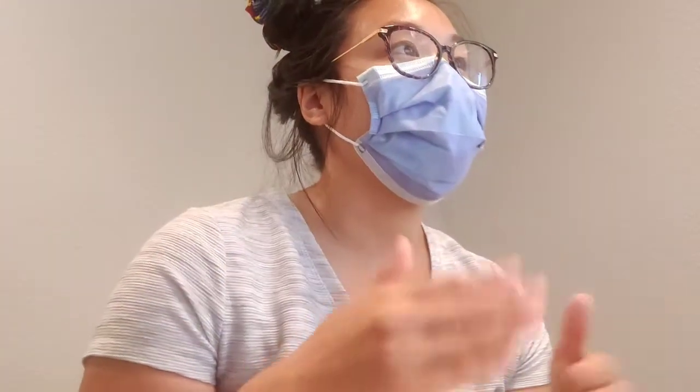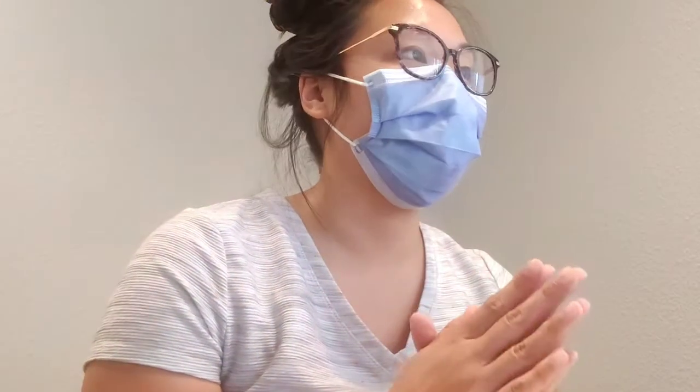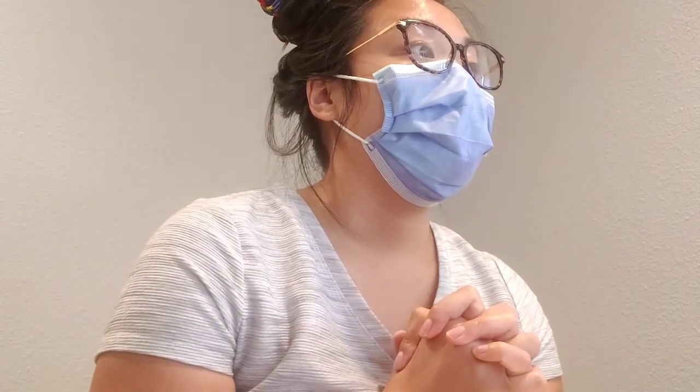So the standard window width of blank is used to demonstrate brain tissue. Now, I'm really bad at window width and window level. I haven't sat down to really study the window and leveling. I just know what window looks like what. So I put 60 to 80, but the answer is 80 to 100.